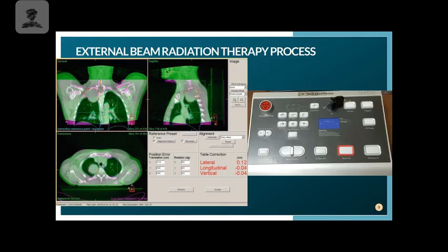Then you see the overlap, the white line that runs across the patient on all three views. And you can see how it hovers ghostly over on this axial image. That is the image we just took that day. Our cone beam can't get the whole body. Our cone beam only has a certain distance that it can cover, and that would be the diameter, from this top location to the bottom. So that's the anatomy that we are imaging, and we're going to overlap.